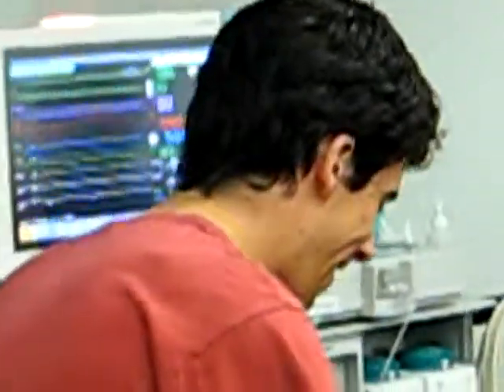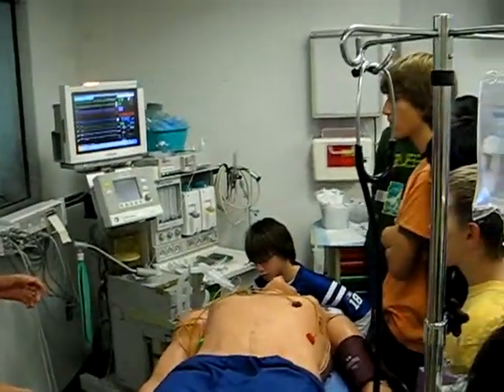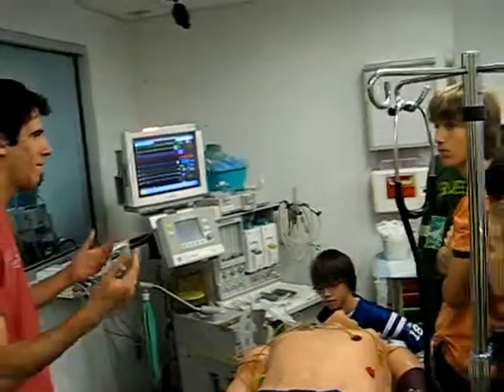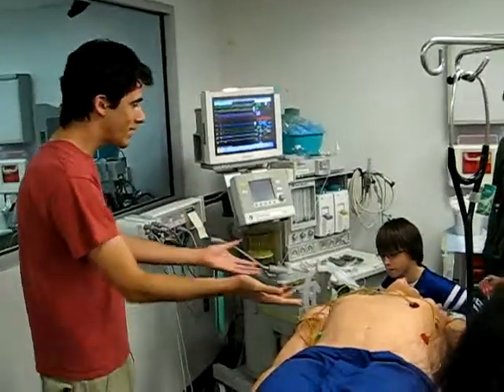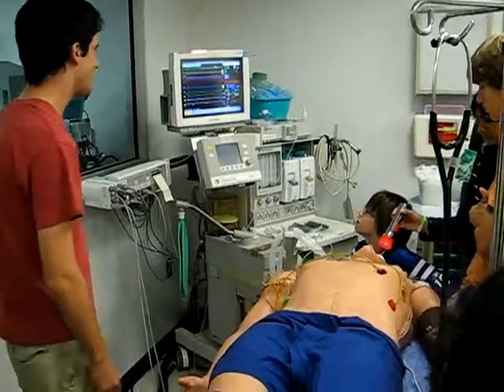Or adrenaline. And I don't know if any of your classmates or any of your friends has allergies, but they've got an EpiPen on them at all times, so in case they get an allergic reaction, you inject it. It is an injection of epinephrine. And so what we just did was that to Stan, except Stan wasn't having an allergic reaction, so he's not going to like this very much.